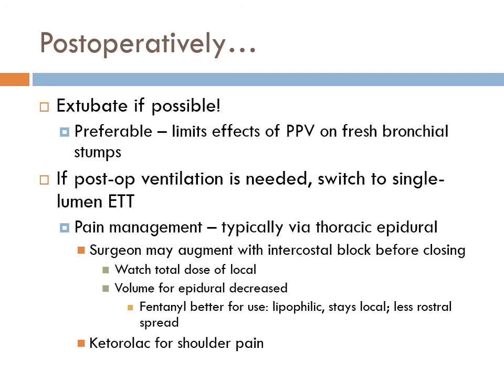So, double lumen tube. I have an exchange catheter, which is a little bit nicer. But with the double lumen tube, which one would I go down? I think I'd go down the trachea. So you go down, the trachea would be the best. See, this might not work. Okay, so see, we're figuring this out right now.